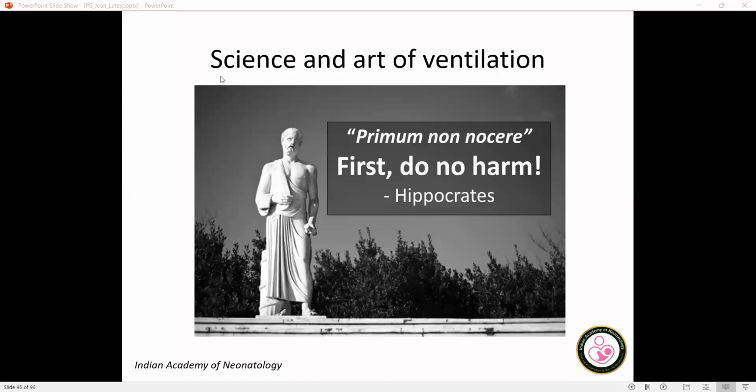So probably in volume targeted ventilation you can identify it based on these two alarms, I think. In pressure targeted ventilation, I'm not sure whether you will be able to; you will not achieve the tidal volume you would want, but there will not be any particular alarm or waveform changes which you can identify. That is my guess, but I don't know whether this has been discussed anywhere in any textbook.